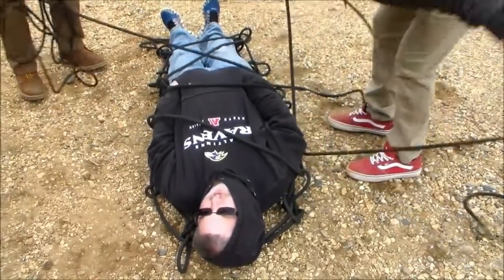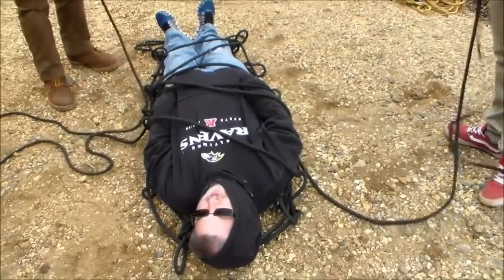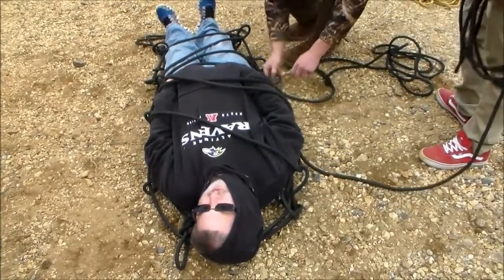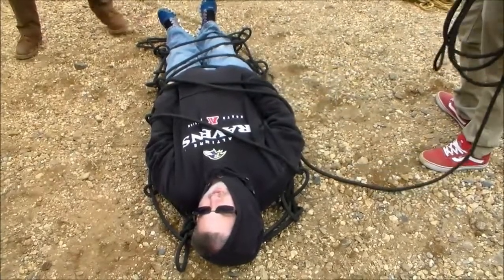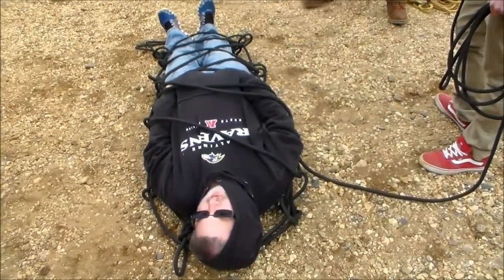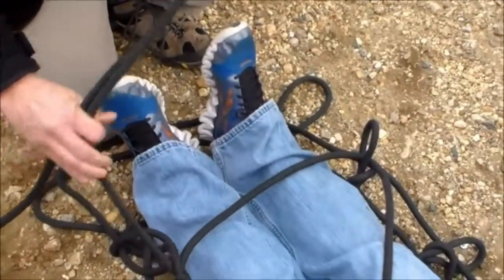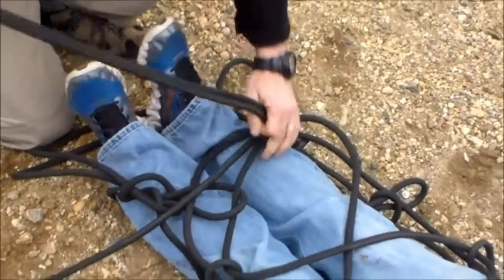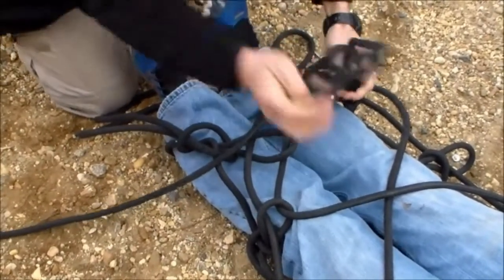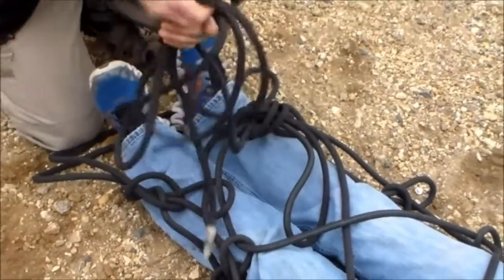We're trying not to step over our patient while doing this. Once we reach the end, we'll secure off that rope. We'll finish by tying it off — I'm going to double up the rope since there's a little extra, and use that half hitch. Take the rest of the rope, coil it up, and tuck it out of the way.